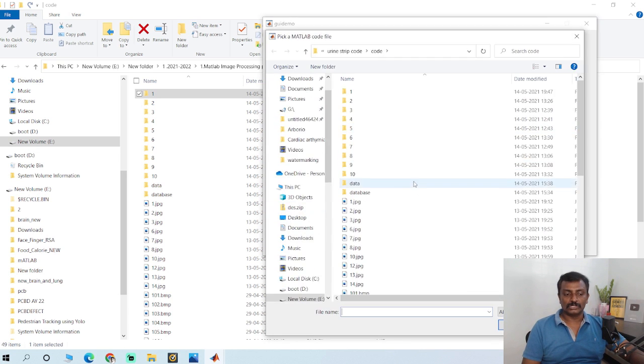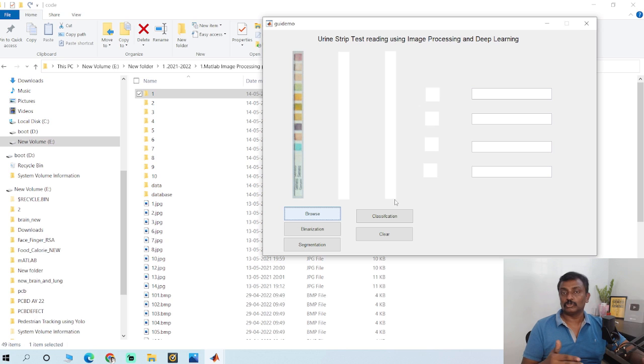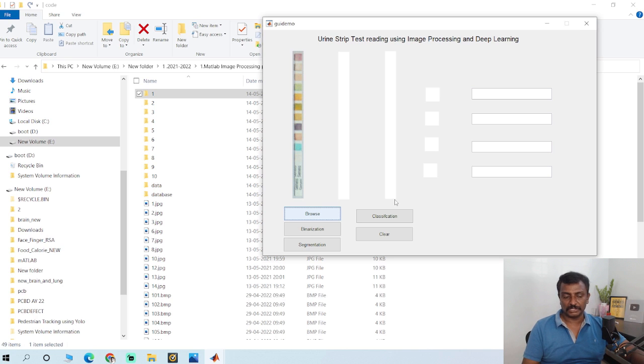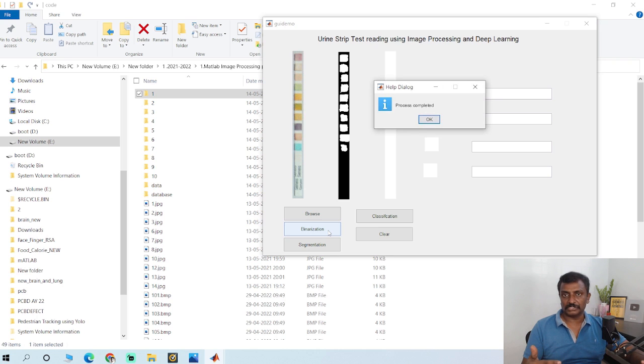Once you get the image from the camera, you have to do binarization to create a mask which is used for segmentation. Click binarization.